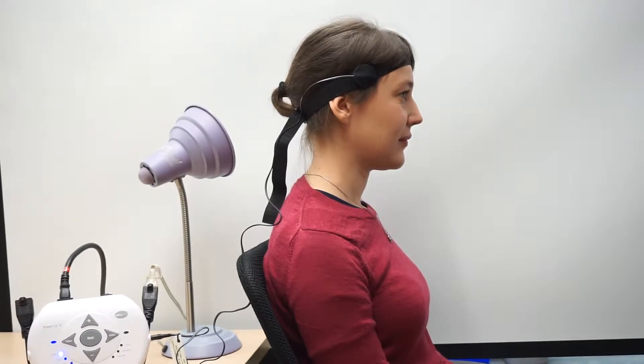Today we're going to talk about the Enabling Devices Tilt Switch, which is model number 990 on the Enabling Devices website. Here we have our user sitting in front of us with the device actually mounted.